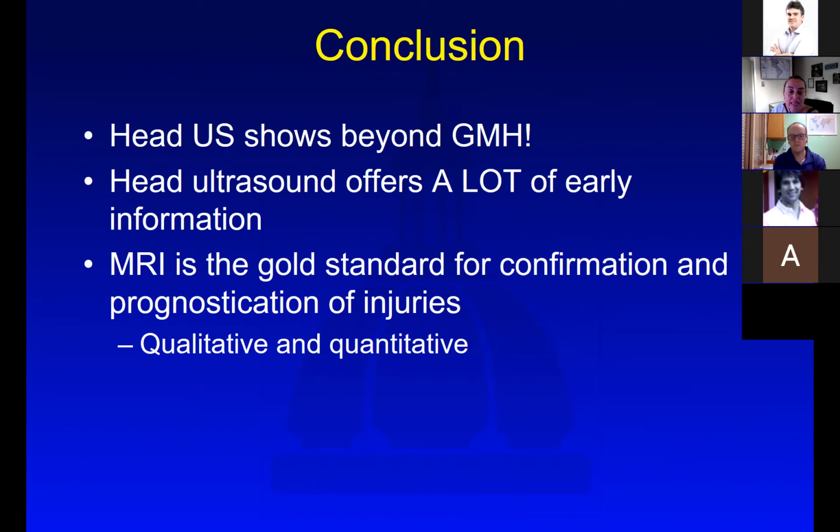If we ever see a neonatal brain CT, it's typically a referral from another hospital. And honestly, I feel more challenged reading those CTs because the density of the brain parenchyma, you expect to see hypodensity because of the immature myelination, but it still makes me feel shaky because I don't look at them very often anymore. Yeah, that's it.